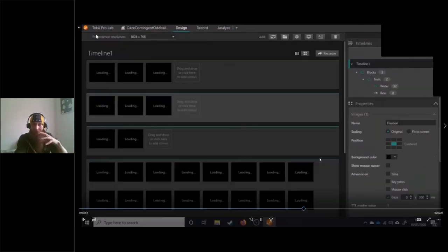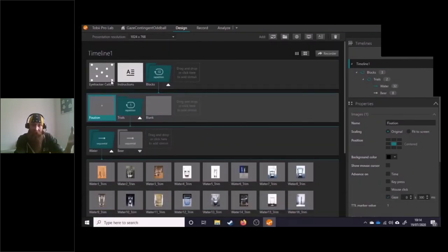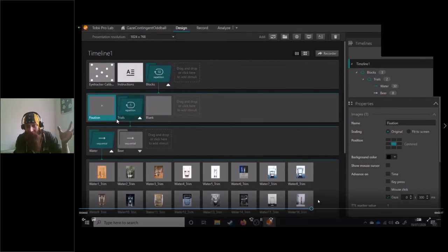Simple as that. We can also set a duration there. So I set it to progress after 300 milliseconds. I'm obviously not too fussed at the moment. This is just an example recording.